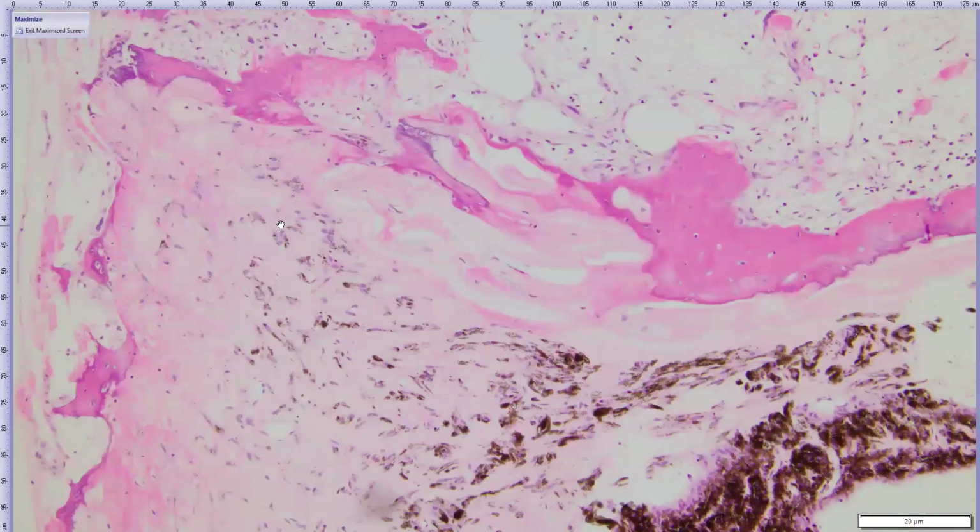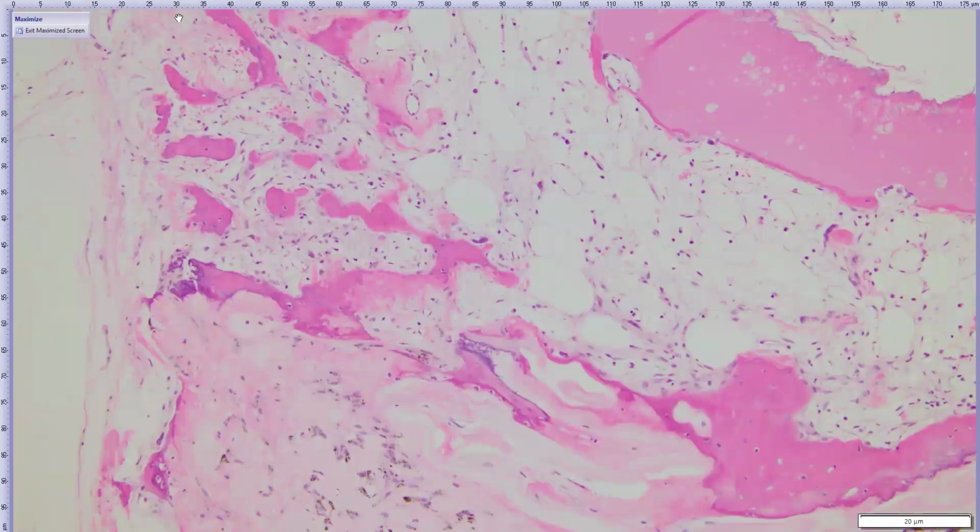And if we continue to follow it, we maybe pick up the other end over here. So here's that super wavy, wrinkled lens capsule. And this osseous metaplasia is adjacent to the lens, but it also seems to be somewhat within the capsular bag itself. So here's the inner surface of that lens capsule, and we have that bone being laid down against that surface. The capsular bag also contains some liquefied and fragmented lens fibers and just a ton of mineral and more fibrous tissue.